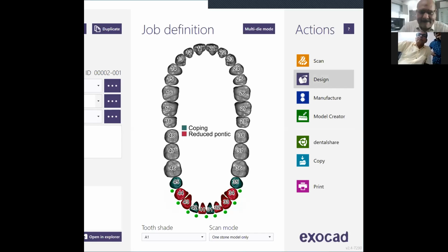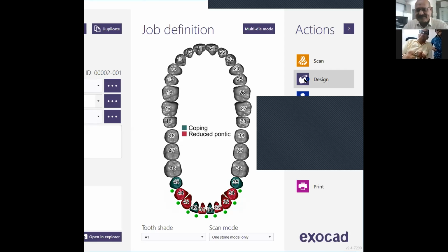Okay. So that is why I would say that please consider milled custom abutments. The printed ones should be avoided. With milled, you can use company screws and life is assured.